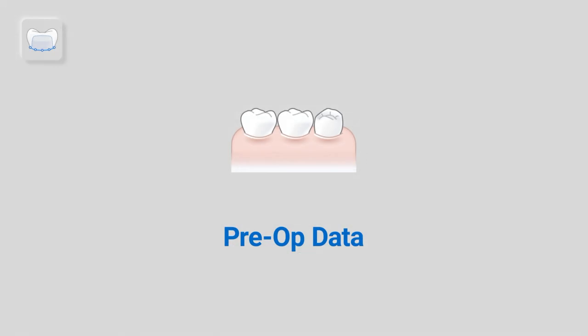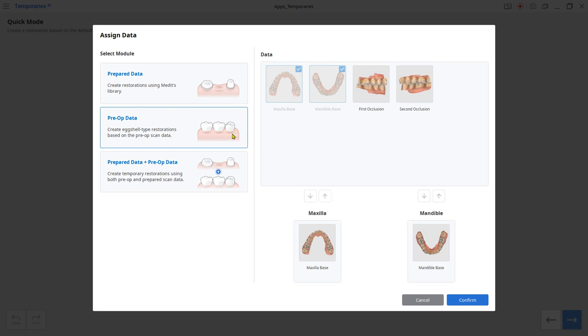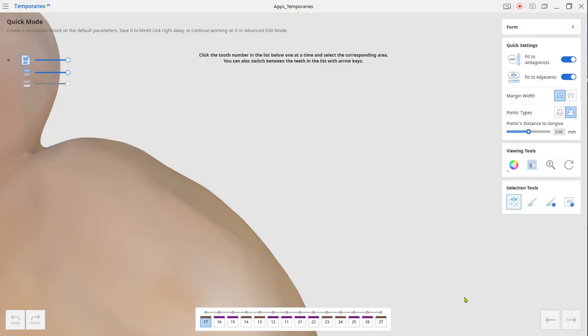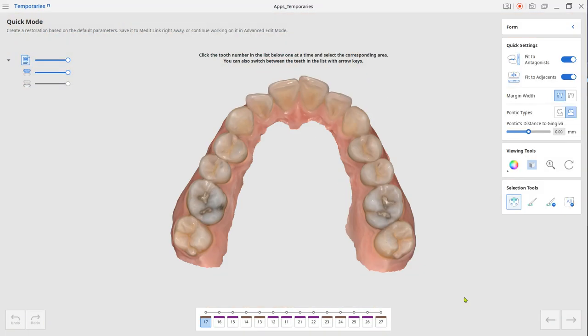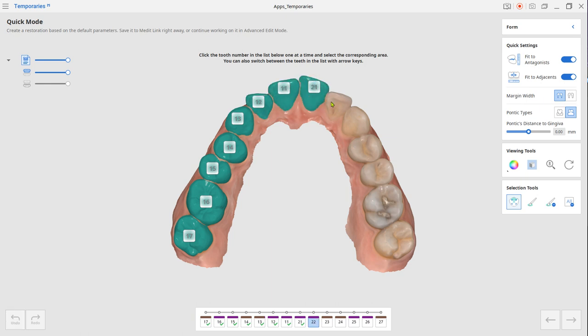Choose the Pre-op module for an eggshell-type temporary crown. Click on the tooth number from below and select the area accordingly. For the tooth selection, you can use the arrow keys instead of a mouse click.